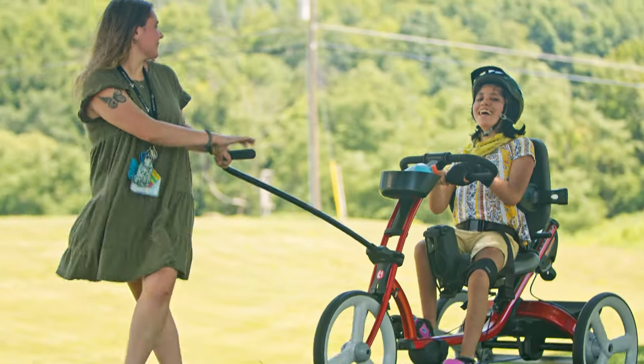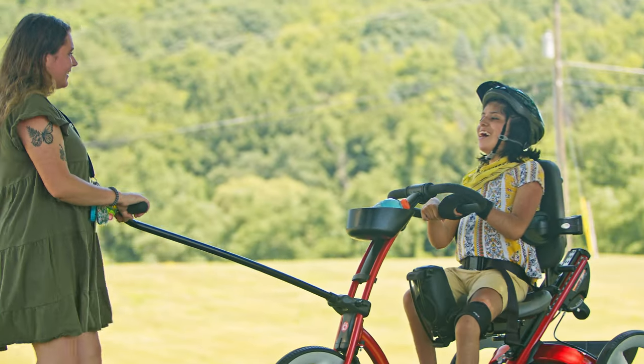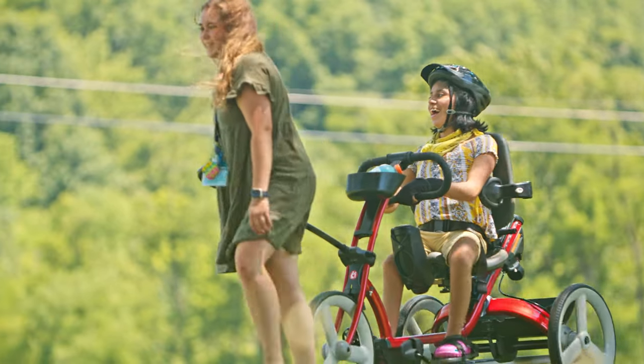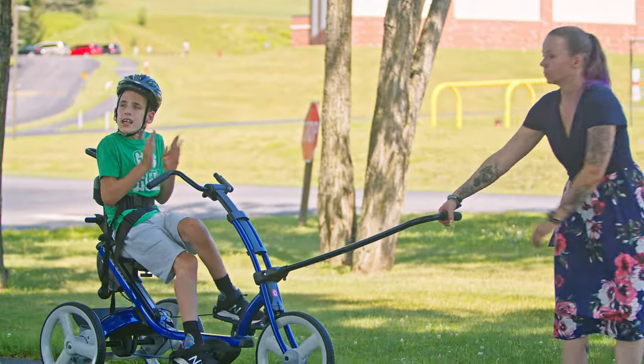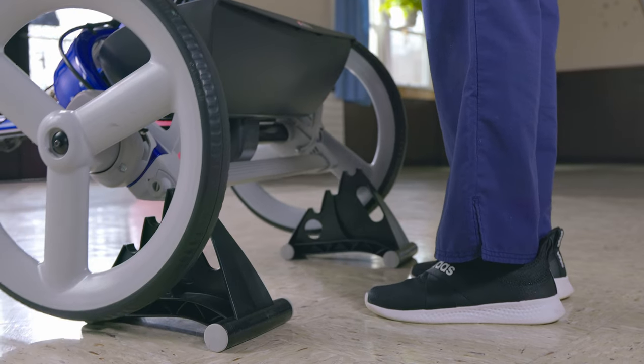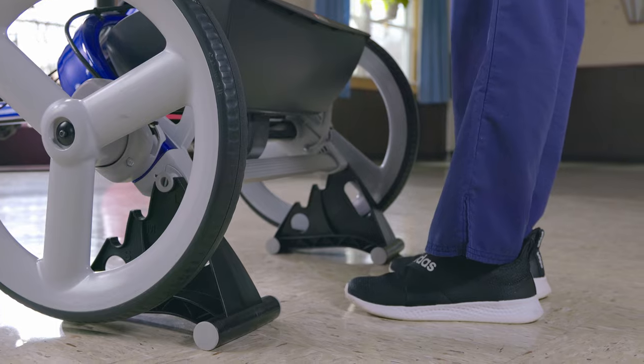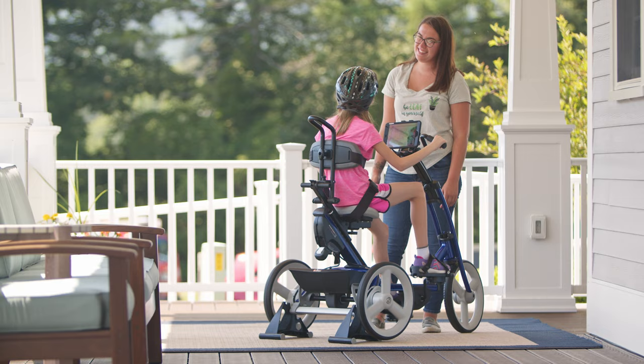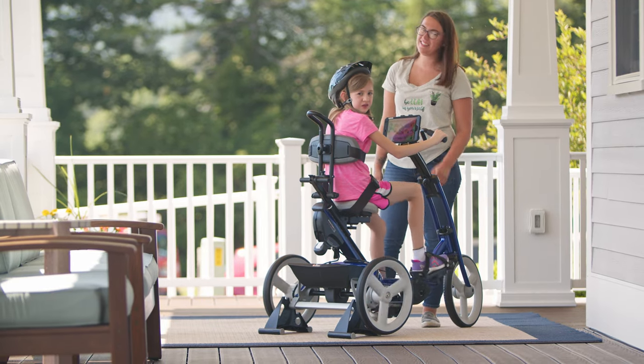This is the front guide bar. We can use it to guide the tricycle from the front while face-to-face with the rider — some more involved riders may benefit from encouragement and assistance from a caregiver out in front of them. The stationary stand elevates the back wheels of the tricycle, and this same stand works with all three sizes — you just put the rear axle in the correct slot. This turns the tricycle into a stationary exercise bike, which can be very effective for people on the autism spectrum or those with intellectual disabilities, especially in bad weather or where space is limited.